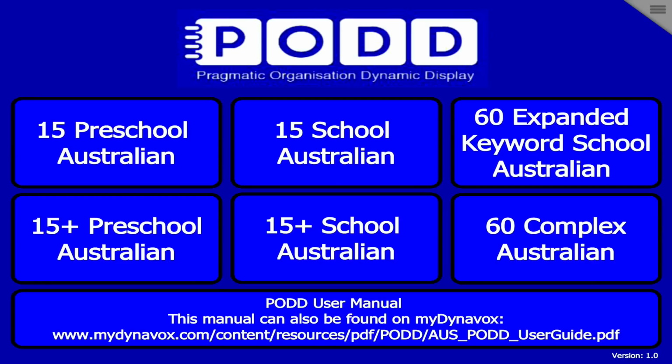And so this is the Pod Australian version. There's also a US version. And with these page sets, you have 6 options available. So we have the 15 and 15 plus for preschool, so a lot of vocabulary centered around preschool.